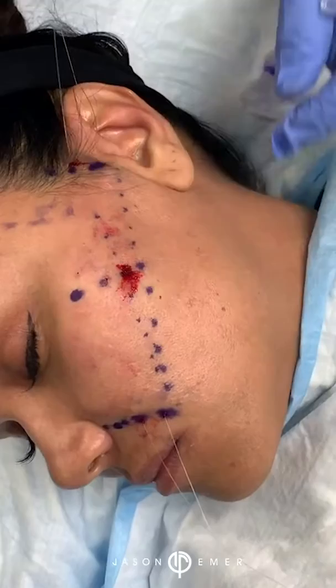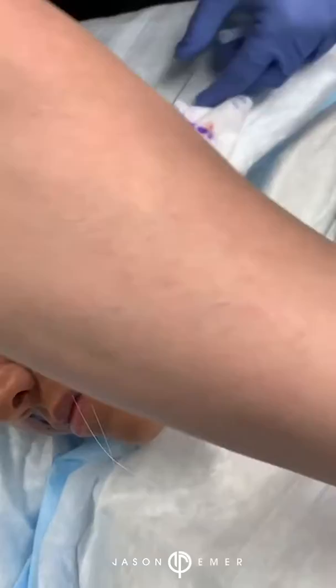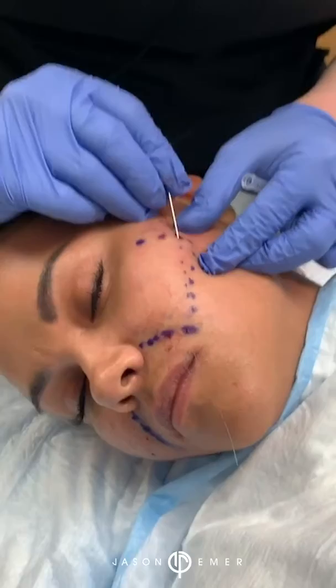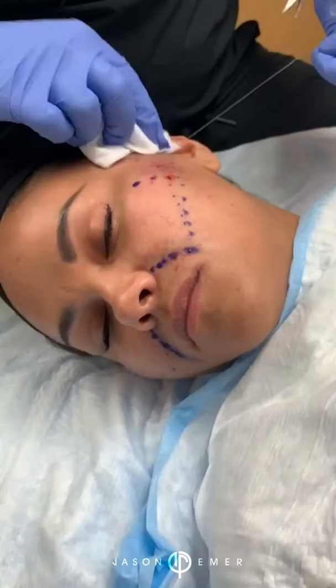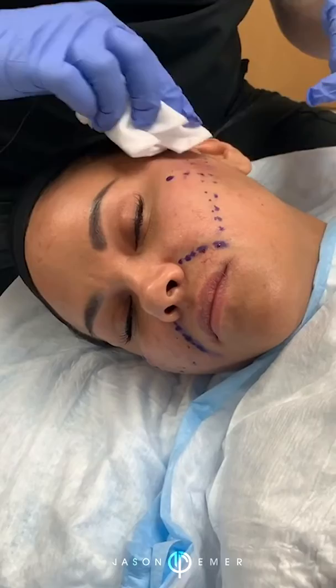What we're doing here is literally going under the surface and anchoring those sutures into the spots that we want, to get her a nice lift. Long term, that's going to give her a nice underlying support without having to have a lift — an early lift.